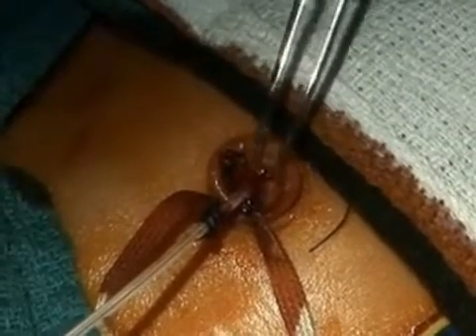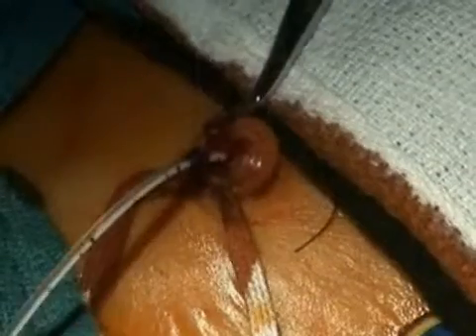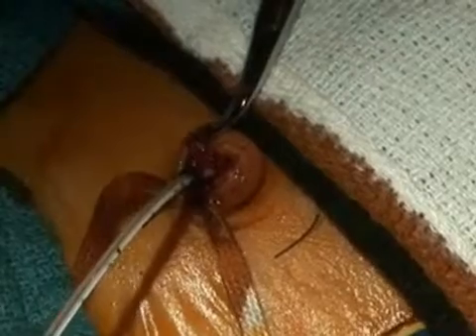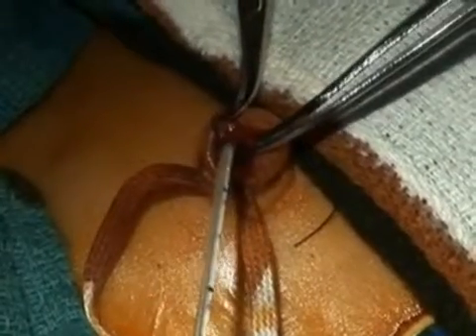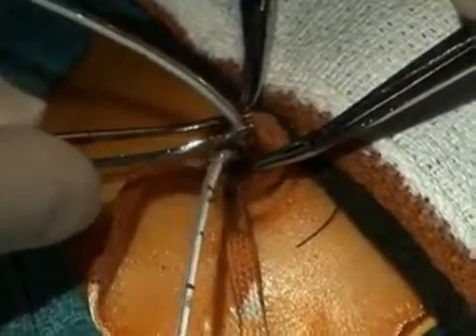To insert an umbilical vein catheter, with your non-dominant hand, grasp the cord with the toothed forceps. With your dominant hand, using the mosquito forceps, remove any blood clots from the entrance of the vein. Using the mosquito forceps, introduce the pre-flushed venous catheter attached to the stopcock and syringe into the lumen of the vein and insert 3 centimeters.